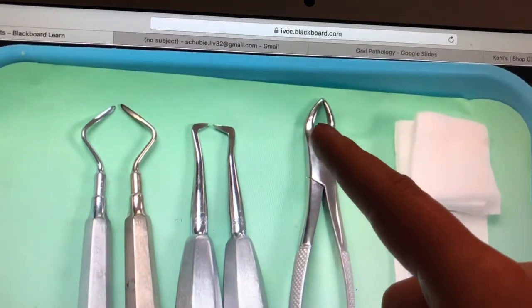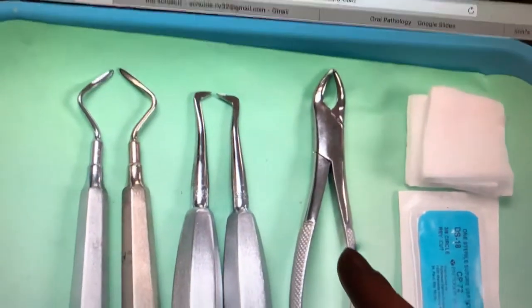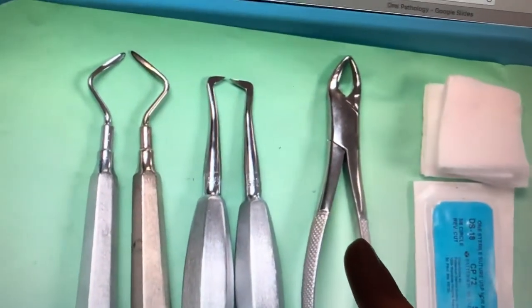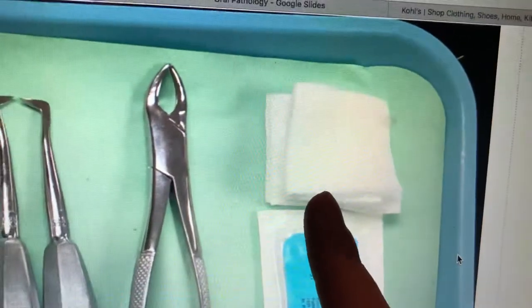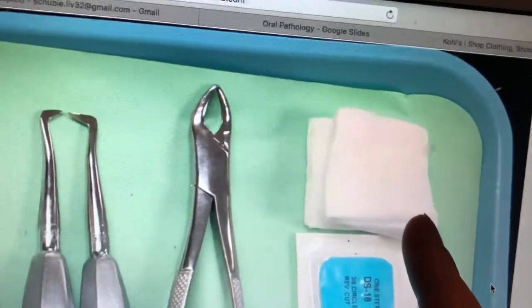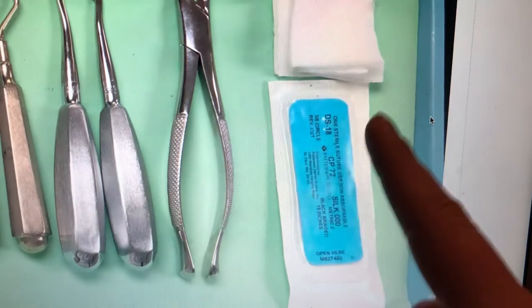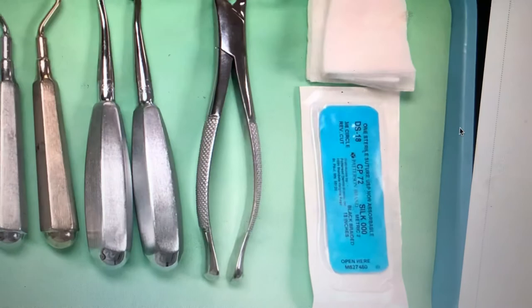I'm going to guess this is the maxillary universal forceps — I'm taking a wild guess because it's kind of hard to see in the picture — but this is going to be used to extract any maxillary teeth: centrals, laterals, canines, premolars, and molars. Then we have two-by-two gauze, used to dry areas, place topical if needed, and remove debris from instruments. Finally, this is our suture with a needle, and that's going to be what we use to stitch them back up at the end to close the site.